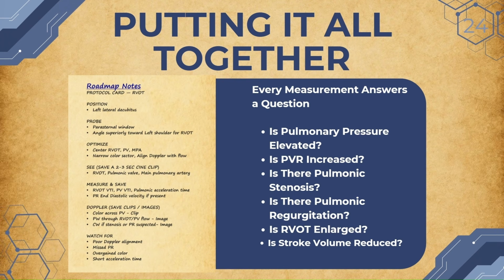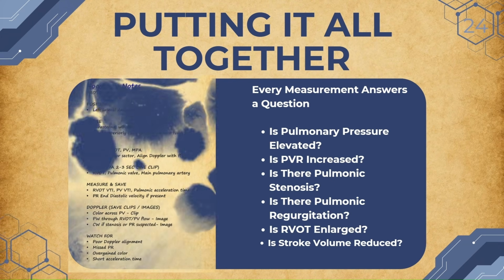This is the most important slide in today's lecture. Our goal is not simply to collect measurements. Our goal is to answer questions. Every image, every Doppler tracing, and every measurement should help us better understand the patient's physiology.